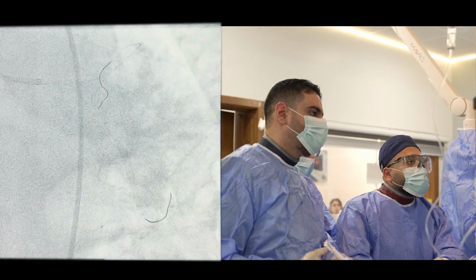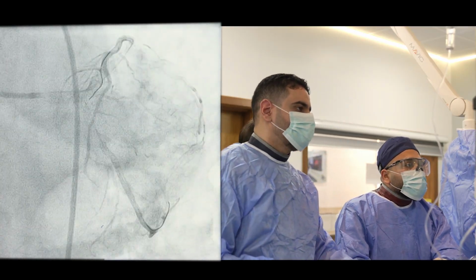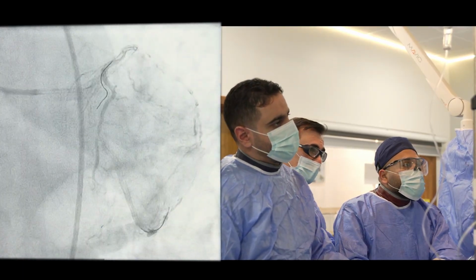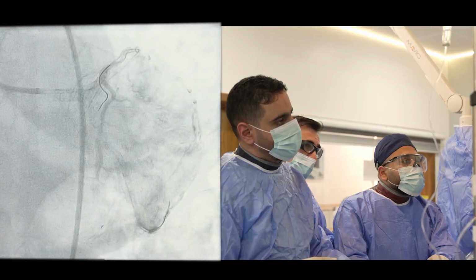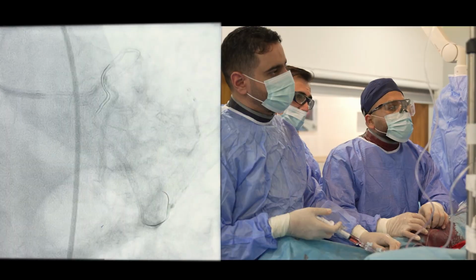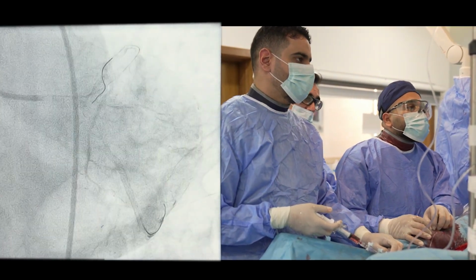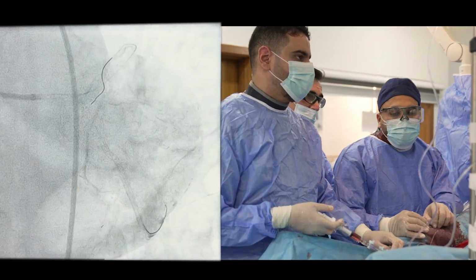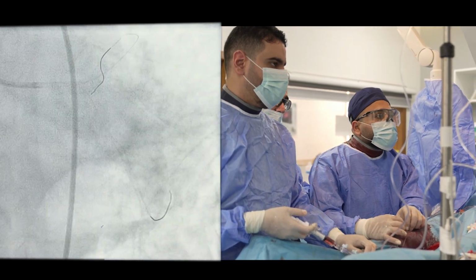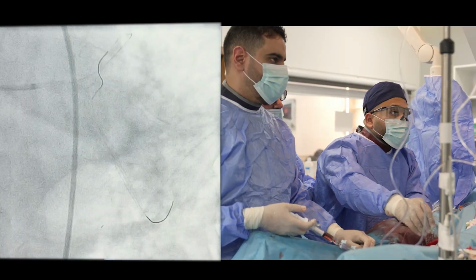Okay. Go. Good. We have some jeopardy in the jeopardization of the ostium of the circ. Probably before doing POT, or we need to recross. The POT we are going to do by balloon 5, the left main diameter was really 5, so I think the stent is just covering the left main diameter, and we don't need to go more than that. But probably we need to go more for the aneurysmal part of the LAD.